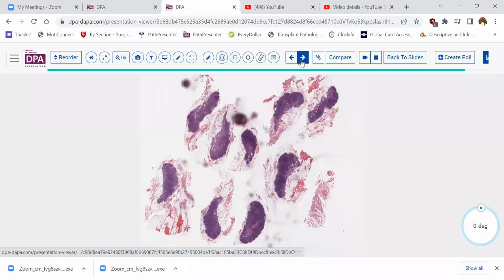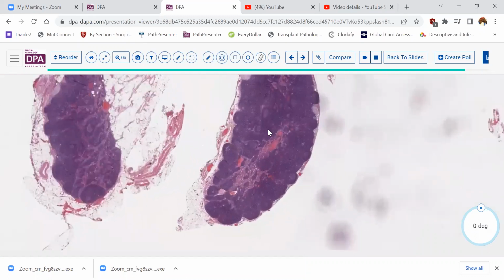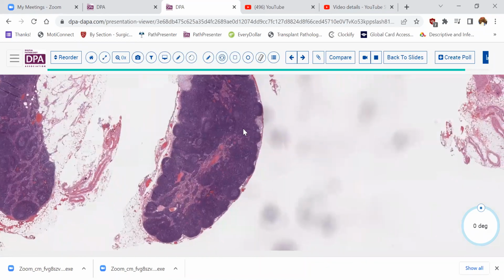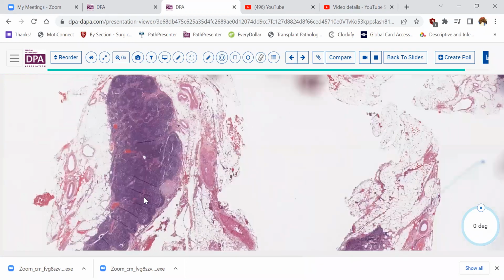This is a patient who had cervical cancer. And in the course of treatment of her cervical cancer, the surgeons did some lymph node dissection, taking some sentinel lymph nodes and sending those for evaluation. And as you can see here, there are a few foci in the capsule of this lesion that are a little bit odd looking, a little bit of pale tissue right in the capsule, forming these little nodular areas.